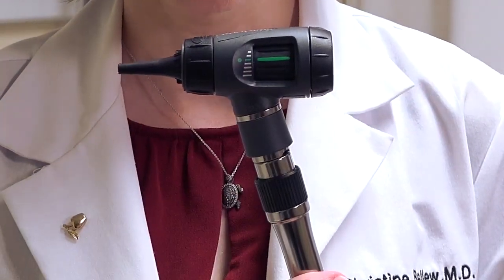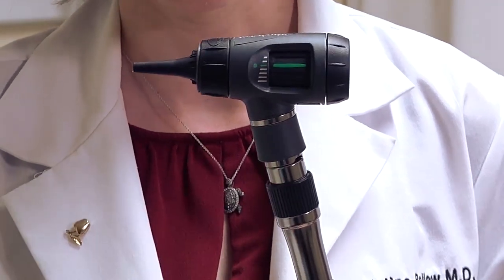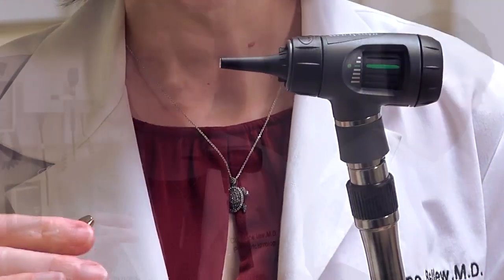The otoscope also has the ability to focus. On the side there is a dial with a green bar on it. When the green bar is lined up with the green line, that's a mid-range magnification — about the same level you'll see on otoscopes that don't have an adjustable focus. I usually start there and make adjustments as needed.